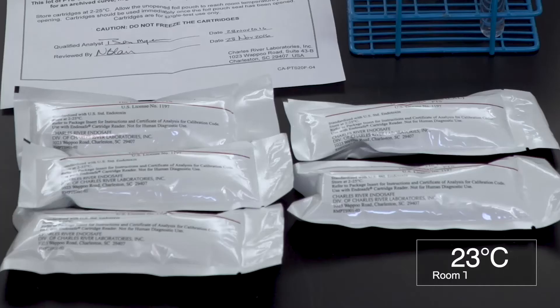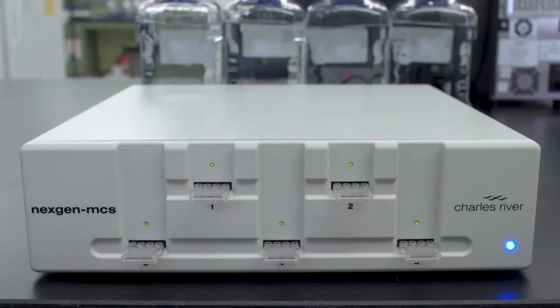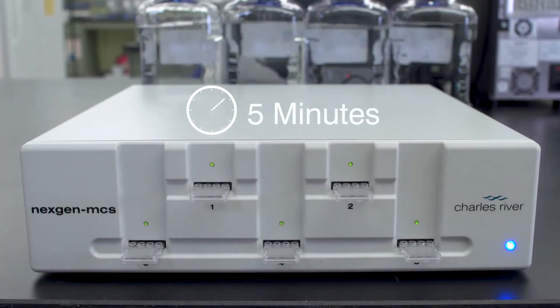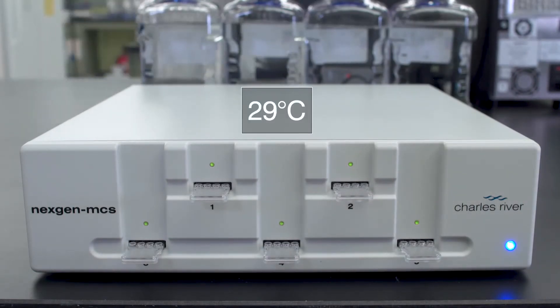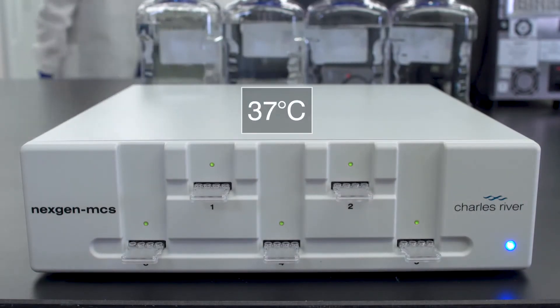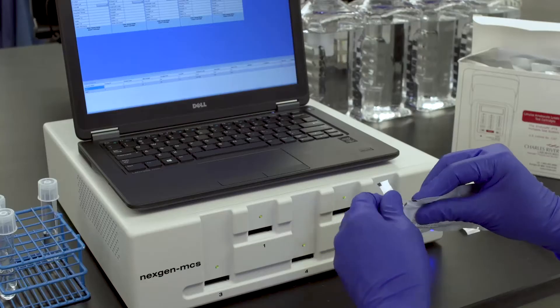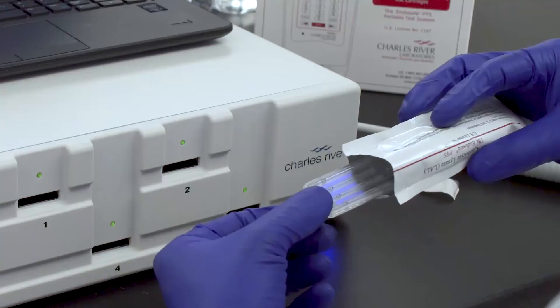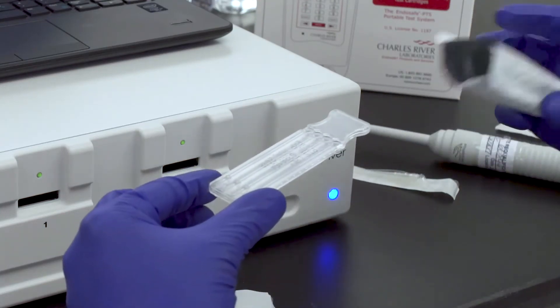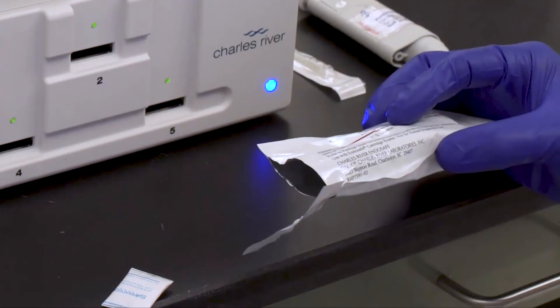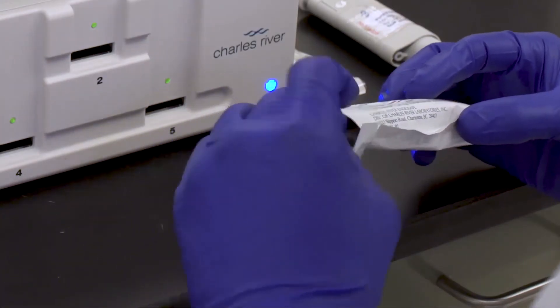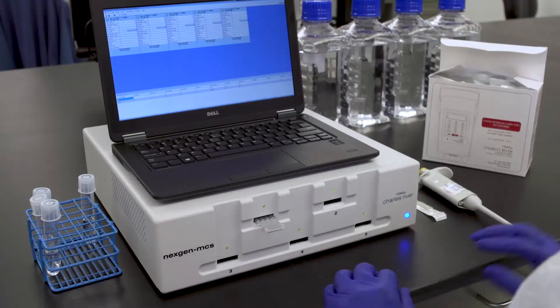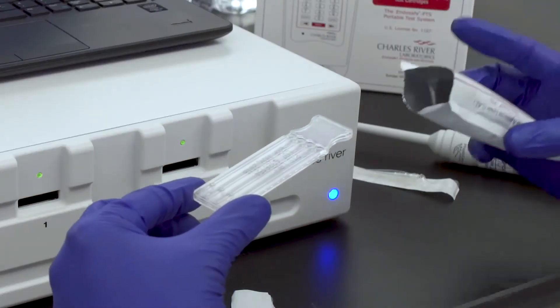Please allow your cartridges to come to room temperature before removing them from the pouch. The system will perform a self-test and will take approximately five minutes to reach the appropriate 37 degrees Celsius. Remove your cartridge from its pouch. Take care to touch only the handle or edges of the cartridge.